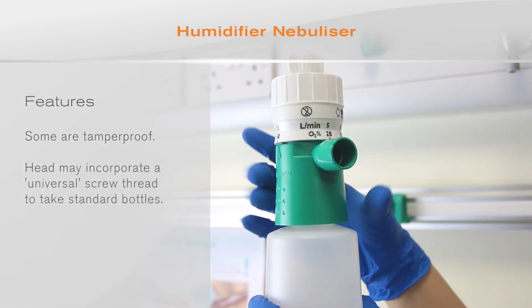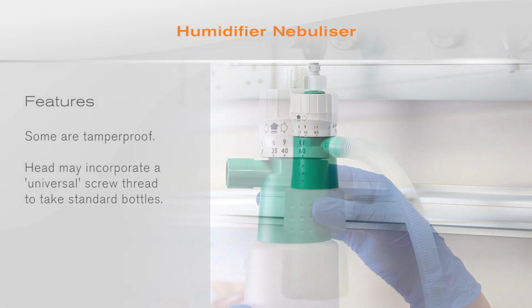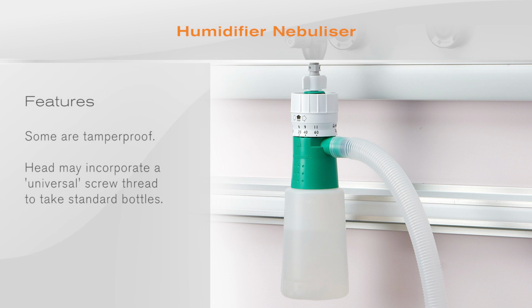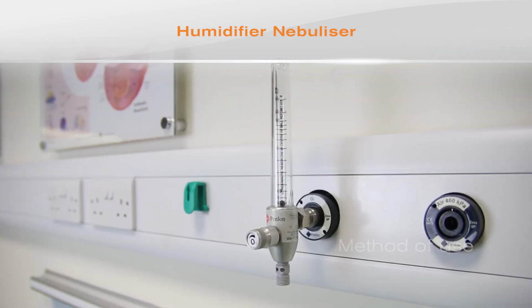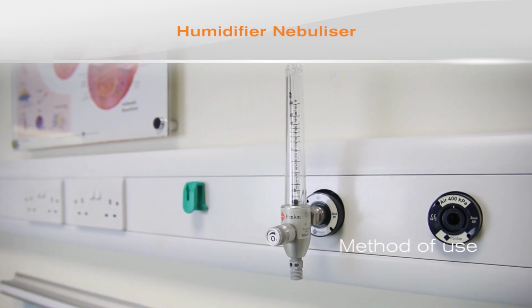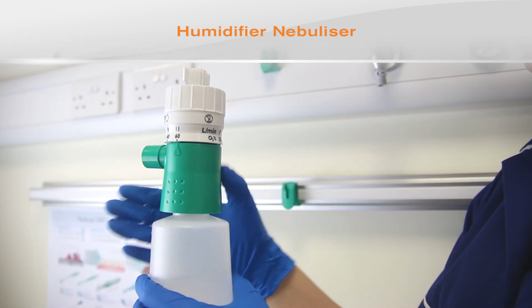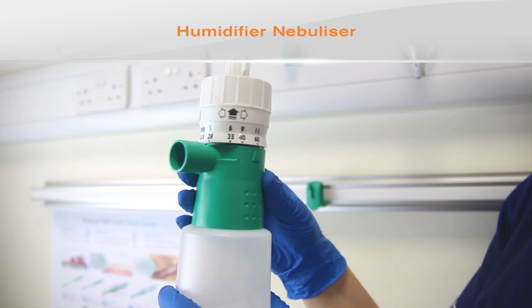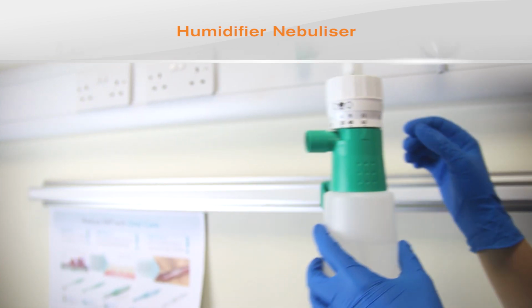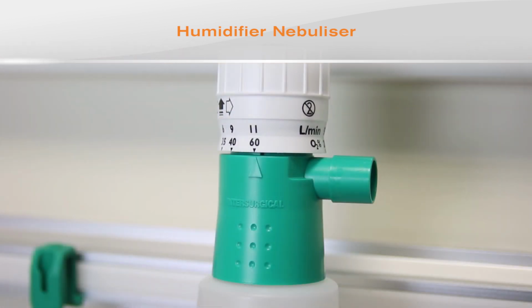The head of the Aquamist nebulizer humidifier incorporates a universal screw thread. This permits the use of a bottle which can be refilled with sterile water or the use of some pre-filled sterile water bottles. The flow meter should be attached to an appropriate oxygen supply. Fill the bottle with sterile water using an aseptic technique and fit to the humidifier head. The humidifier nebulizer should then be attached to the flow meter.